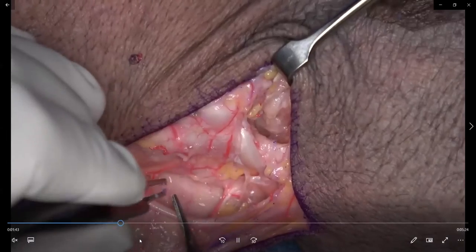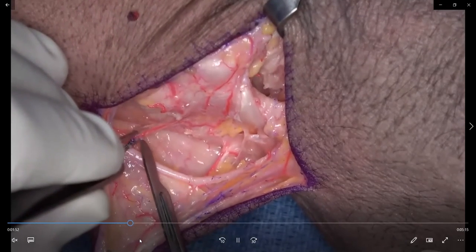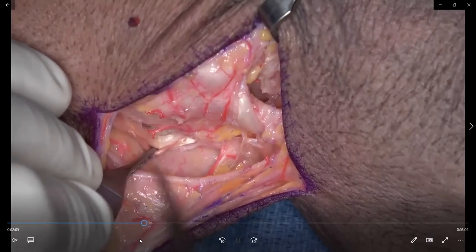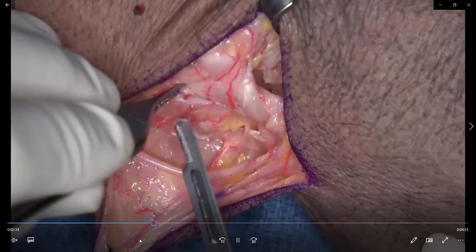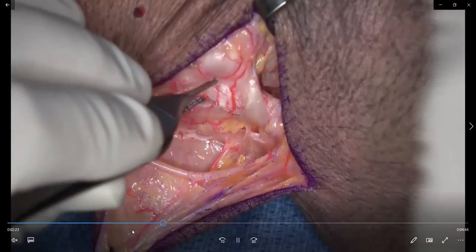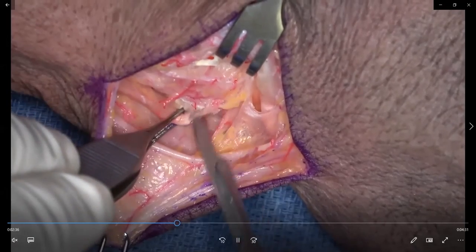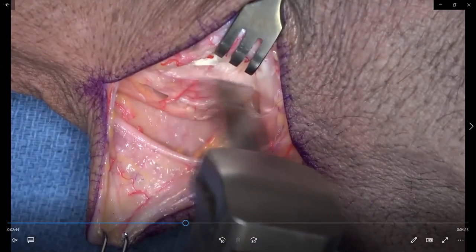The scaphoid is exposed and you can identify the fracture fragments. I'll often put joysticks in to open it up and prepare it however I need to, and I like to do that before I finish harvesting the flap so I know the size, dimensions, and orientation needed. Once you've done that, turn your attention back to the pedicle and vessels — open the first compartment then the second compartment, taking care to leave a cuff of retinaculum between the compartments, sandwiching that small series of perforating vessels between them.